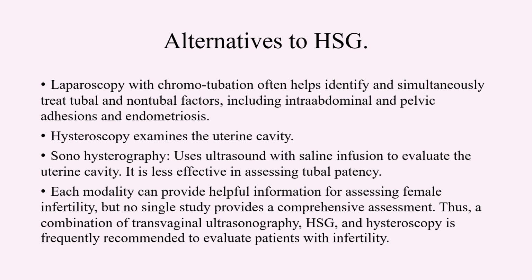A sonohysterography is a procedure where ultrasound is used with saline infusion to evaluate the uterine cavity. It may be considered less effective in assessing tubal patency as no objective evidence is generated during the procedure, and the procedure is totally dependent on the operator.